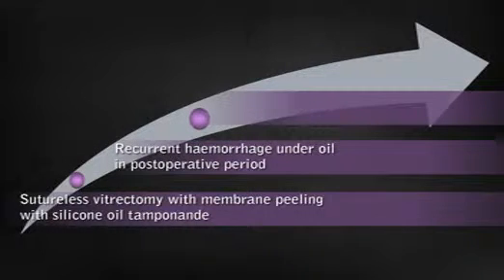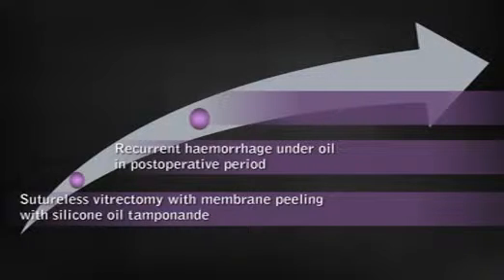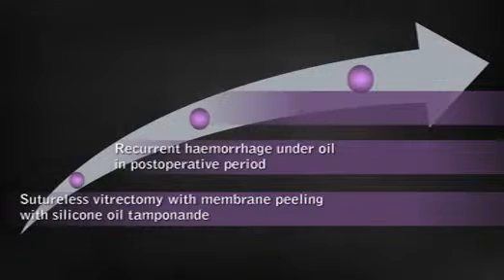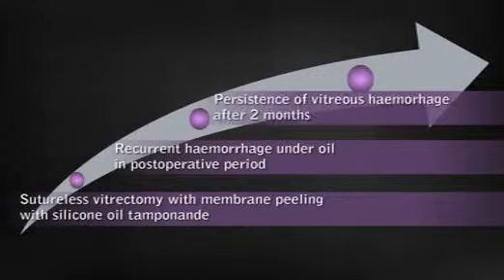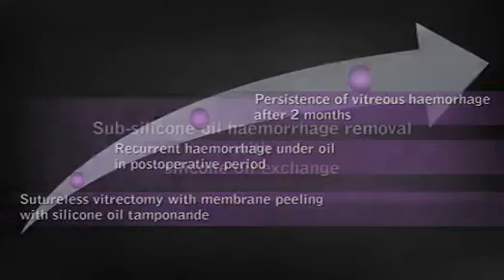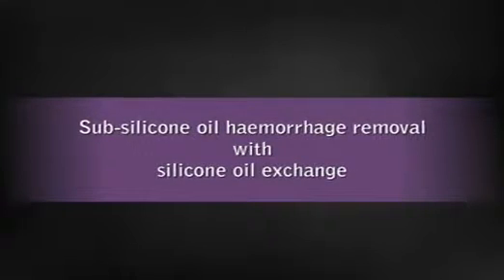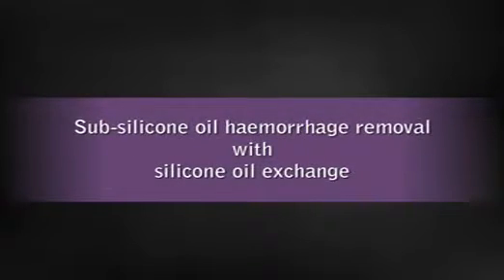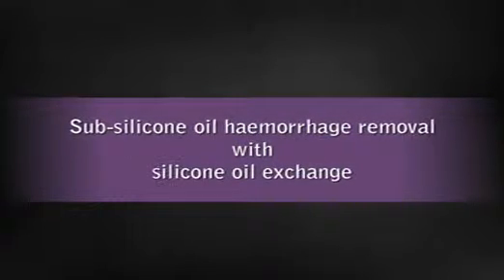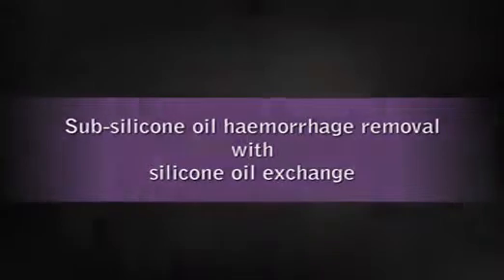He had recurrent hemorrhage under oil in the immediate post-operative period. He was observed for two months for the clearance of the hemorrhage, but it persisted. Therefore, removal of sub-silicon oil hemorrhage along with silicone oil exchange was planned.